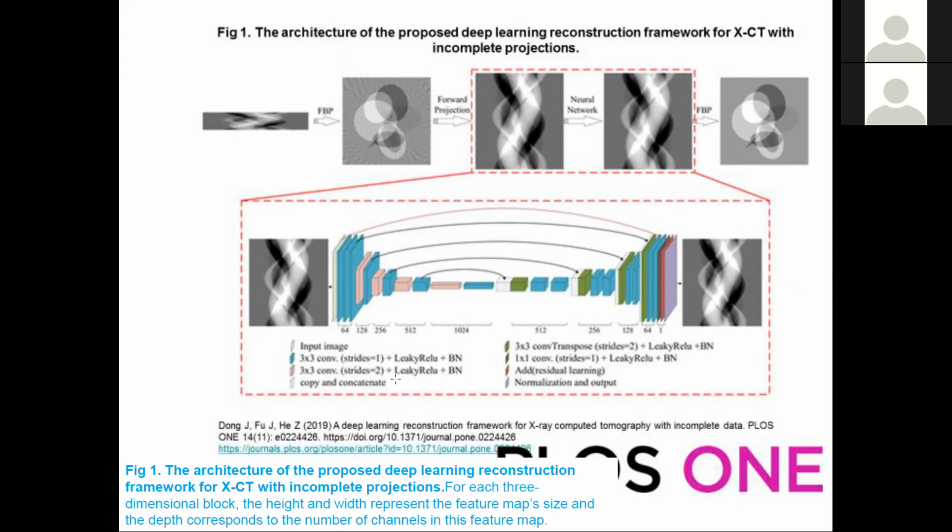X-ray CT, where this illustrates going from the forward projection from the image domain to the projection space. The radon transform and inverse radon transform, supported by fast Fourier transforms, are really computationally efficient. So as a practical matter, it's fine to have your neural net go from a sinogram to a better sinogram, but using it to go from the image to do the forward projection and the back projections, you can do it, barely. It takes huge amounts of memory, and people are jumping through all kinds of hoops to try and do it. But at the moment, it's not nearly as practical as operating just in the image space or in the projection space with your neural net.